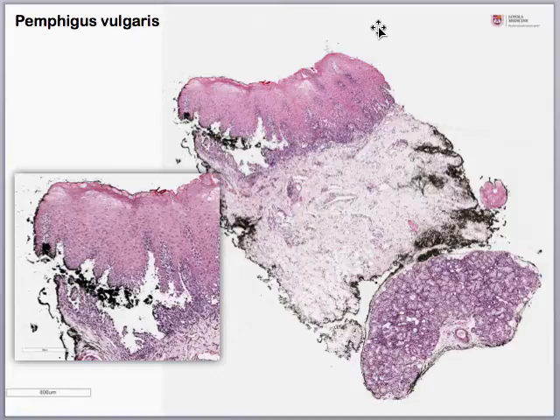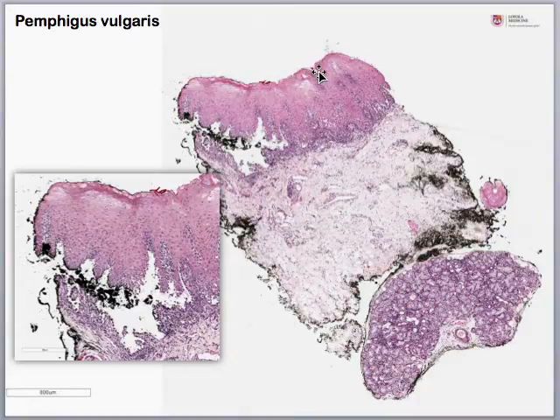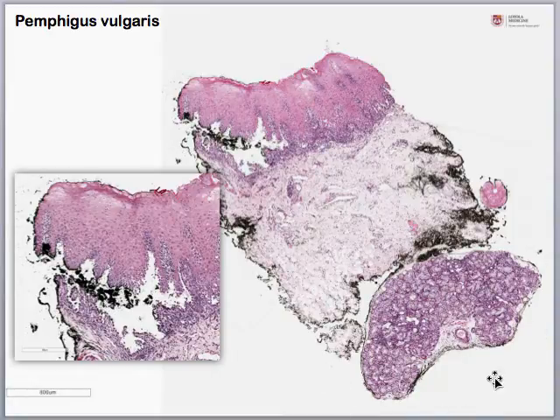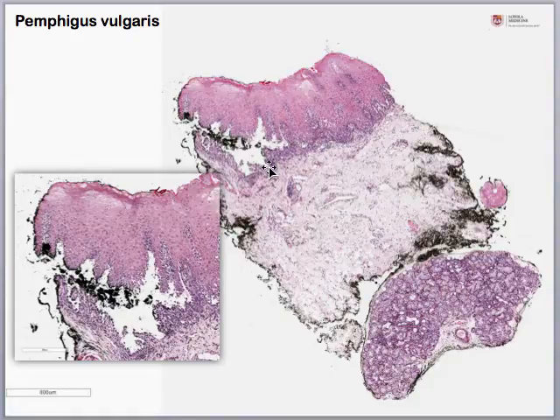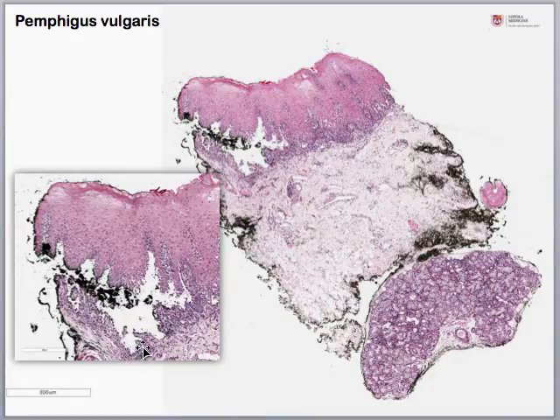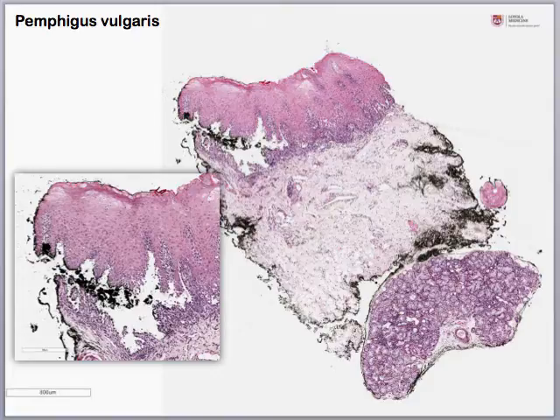Our next case shows two unusual features. First, we're on a mucous membrane — we know this because there is no prominent corneal layer and we can see mucous glands. We can also see a split that is localized to a suprabasilar location on higher power, with the basal layer keratinocytes lining the bottom in a tombstoning pattern. This is very characteristic of pemphigus vulgaris. Generally we would also have an associated positive DIF with a net-like pattern for C3 and IgG.